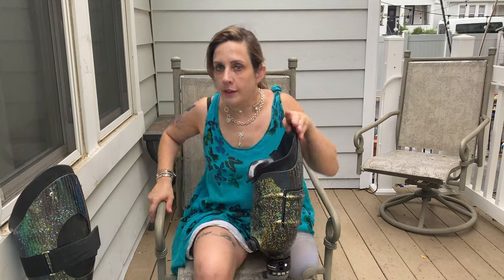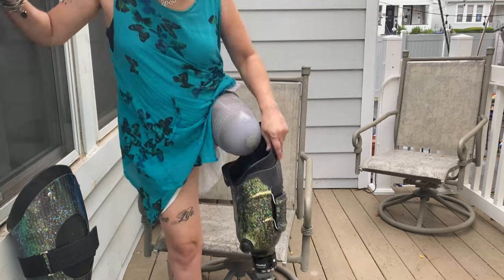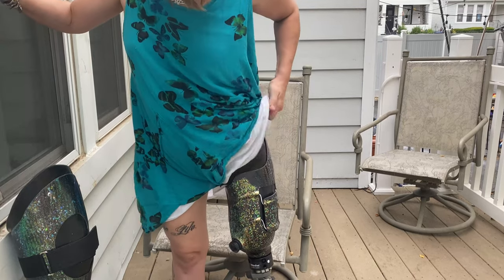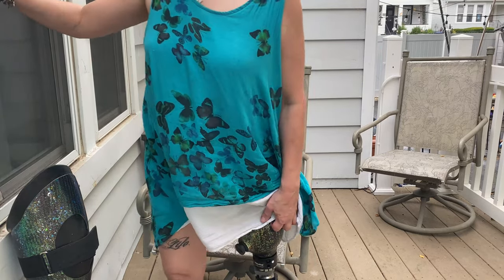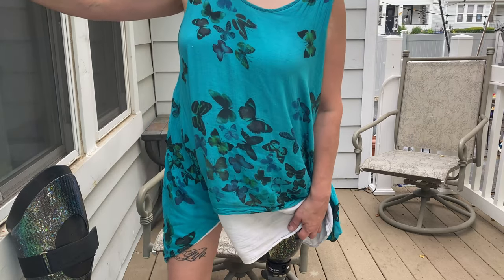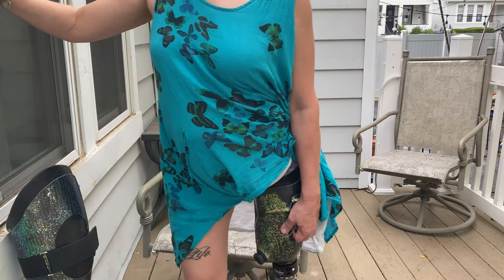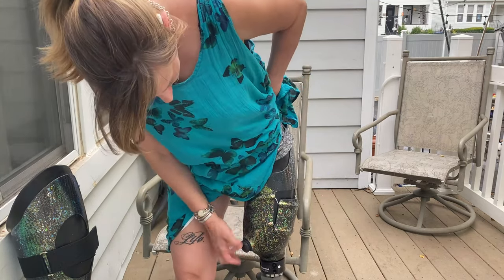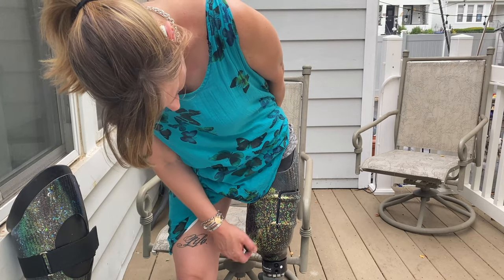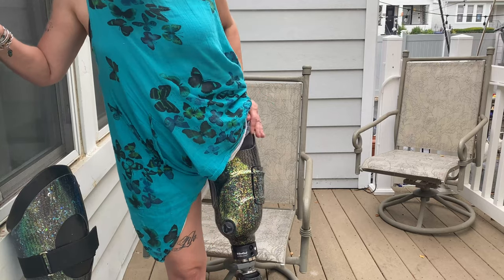In order to put it on, I turn on the vacuum system to suck my leg down in there. It's nice that I can use this as a handle. Tighten it up. Now it's on.